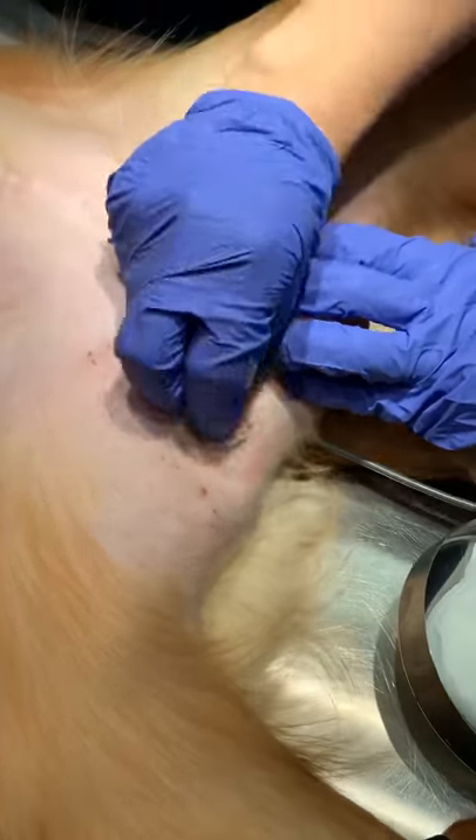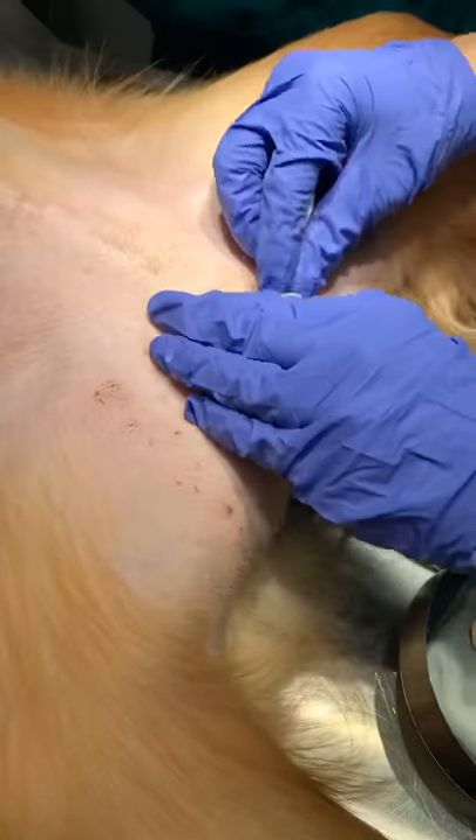And now we are preparing the patient to be scrubbed for the procedure.